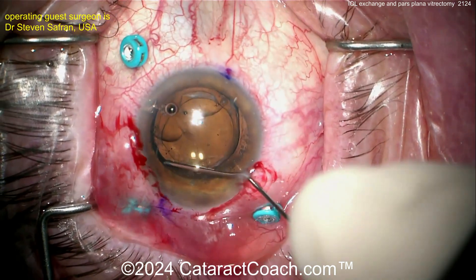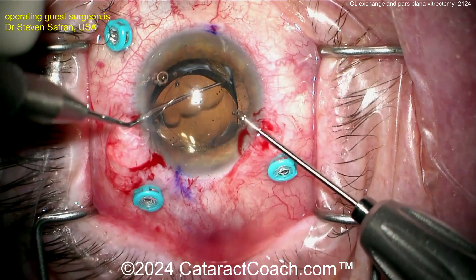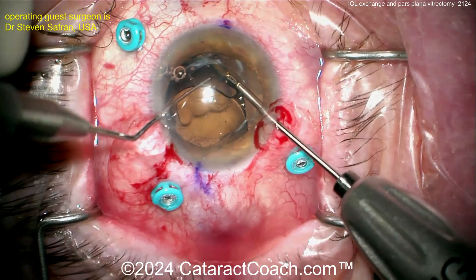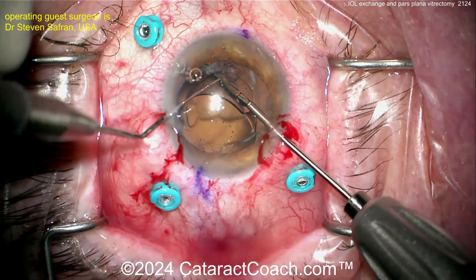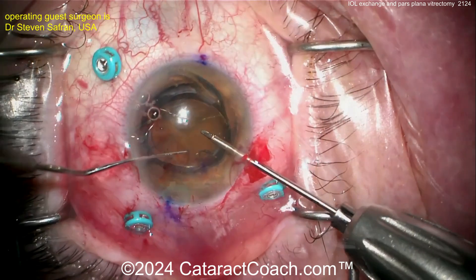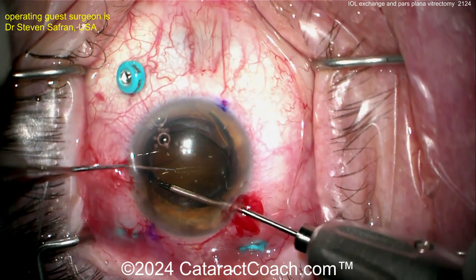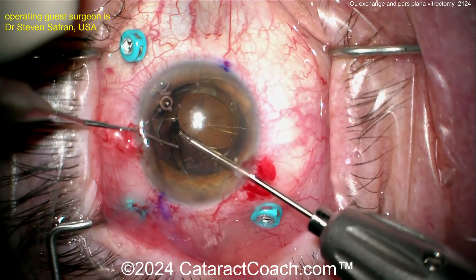Viscodissection to get that fluid wave of dispersive viscoelastic going behind the optic — look at that wave, beautiful. Now remember, you've also got to dissect out the anterior and posterior capsule leaflets. Right now they're probably very adherent to each other, so it's important to dissect them free and be very cautious. I like this two-handed technique here. This lens looks like a Panoptix Toric — it has a bulbous tip on the end of the haptic, so you really want to be cautious and not yank, because you don't want to break the bag.